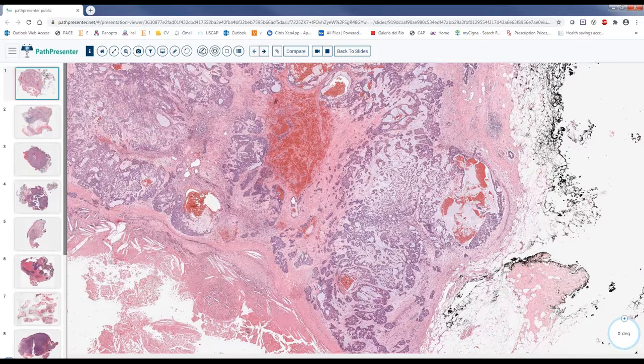But there is a molecular signature. If anybody knows, excellent, Miriam. This is PLAG1. Okay, pleomorphic adenoma gene 1 or HMGA2 rearrangement. It is very important, and we see it around 70% of the time. 70% of the time we see this rearrangement. Okay, so it can be helpful.